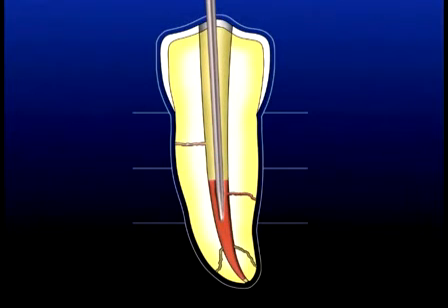Through heating, gutta-percha removal, and vertical condensation of warm gutta-percha, the cycle continues usually about 3 to 4 times, depending on the root length, until the smallest pre-fit plugger approaches the apical 1/3 and can be placed within 4 to 5 millimeters of the canal terminus.